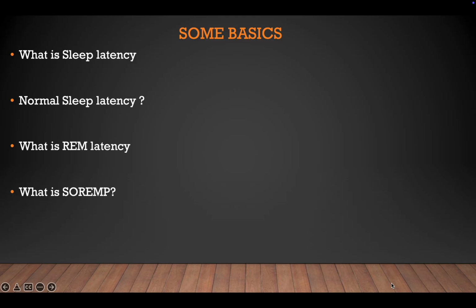But the SOREMP, the sleep onset REM period, means REM sleep occurring within the first 15 minutes of sleep onset, either during an MSLT nap or even during the baseline PSG. So this is a key diagnostic feature of narcolepsy.